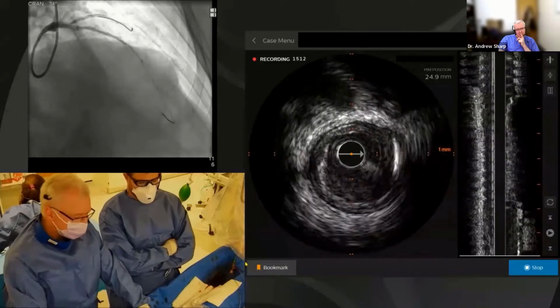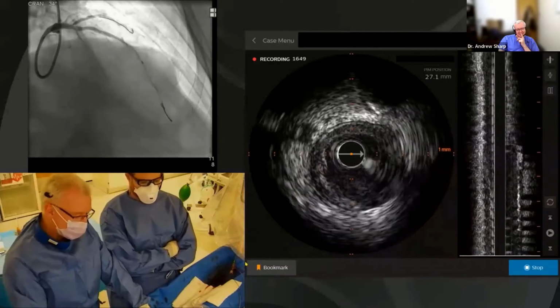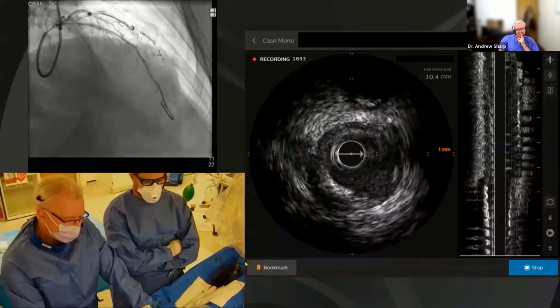Looks almost like there's nothing left, doesn't it? No disease left. And my result. Yeah. Well, we have used drug-eluting balloons before in this scenario, but there you go. You see there's a dissection down there at 12 o'clock, at 6 o'clock.